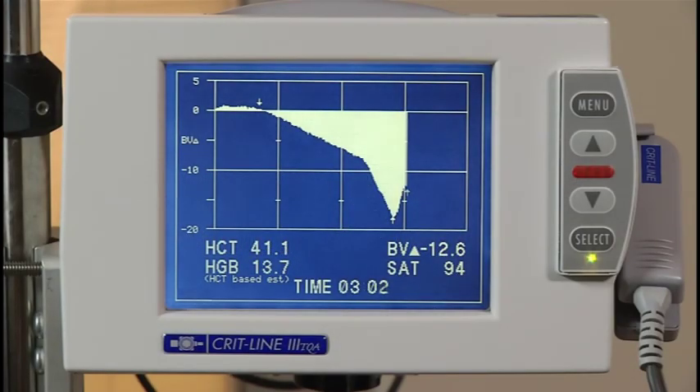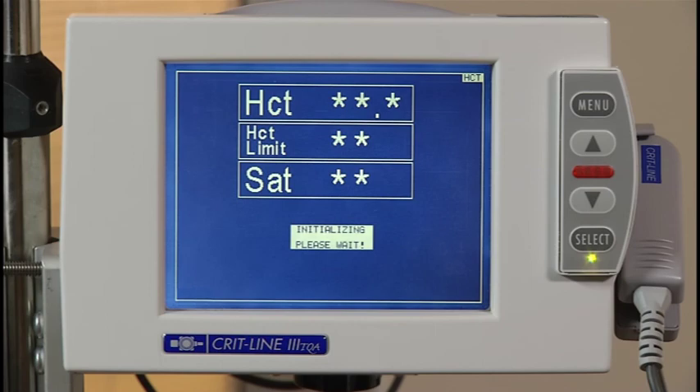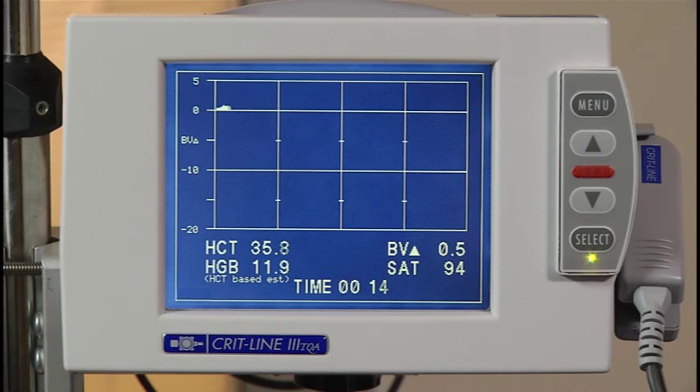Let's review a sample blood volume profile screen. The vertical lines represent one-hour increments, and the screen will rescale if the treatment goes longer than four hours. The numbers to the left of the screen represent the percent change in blood volume, and every patient begins at zero percent. Below the graph you get a reading of the patient's hematocrit, estimated hemoglobin, percent change in blood volume, and oxygen saturation — these values are updated continuously throughout the treatment. In the sample profile shown, the percent change in blood volume is just below zero percent after one hour. This is considered a flat slope and indicates that the patient's plasma refill rate is occurring at the same or greater rate than ultrafiltration. This is considered a Profile A, which suggests that the ultrafiltration rate may be increased without immediate risk of intradialytic symptoms.